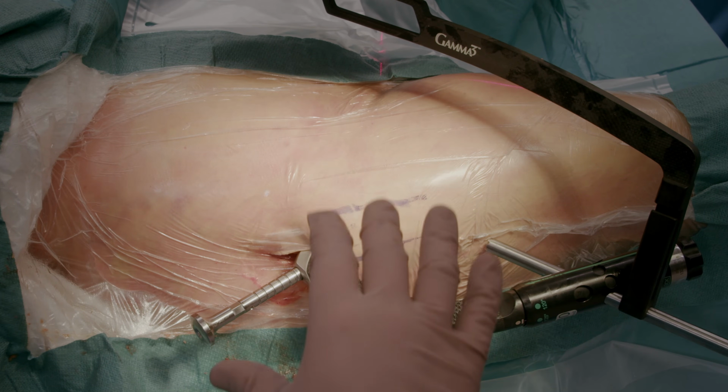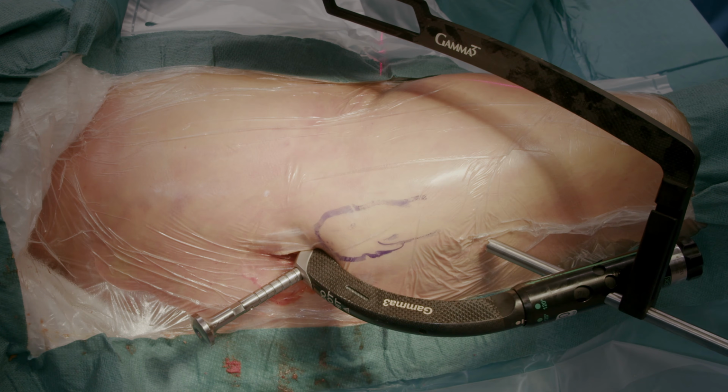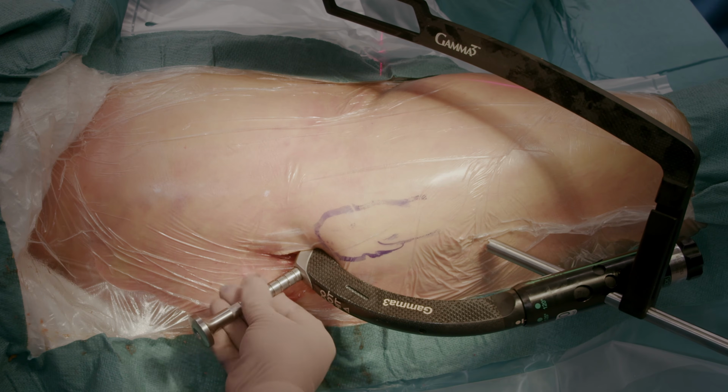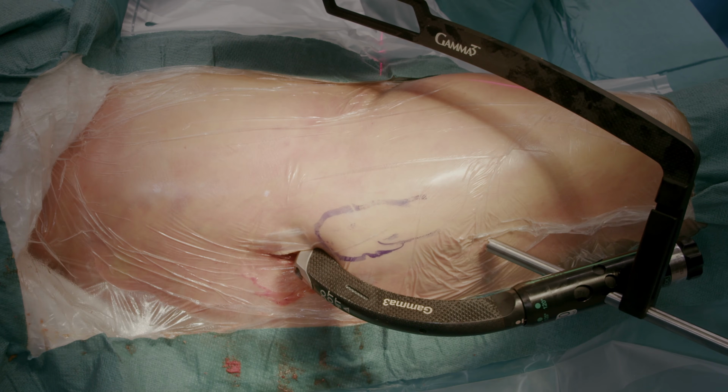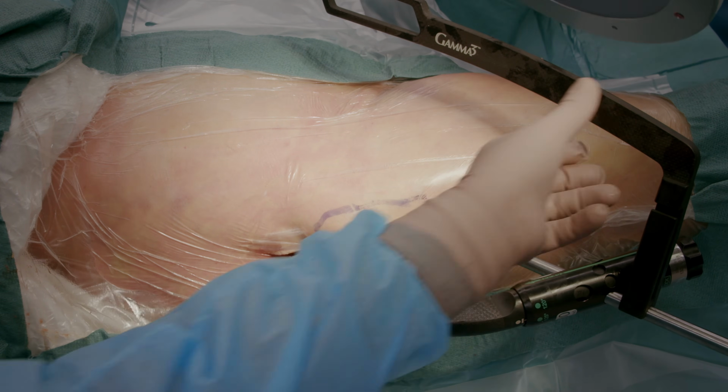After confirming the correct nail level from the AP view, we confirm the correct rotation from the lateral view. We remove the strike plate. We then tilt the C-arm to get the true lateral view again.